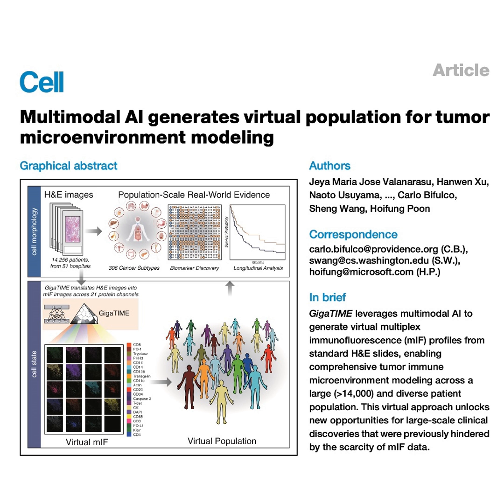That's a whole new way to stratify patients. Did GigaTIME also connect to physical progression like clinical staging? It did. When looking at the TNM staging system, we found that the primary tumor size, the T stage, correlated positively with immune checkpoint and infiltration markers. Meaning as the tumor grows, the immune battle heats up at that site.